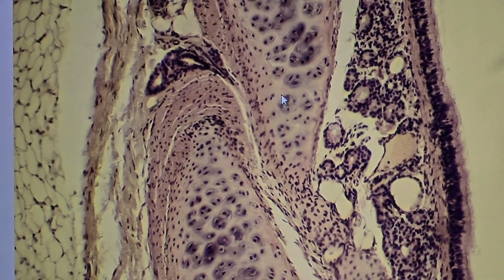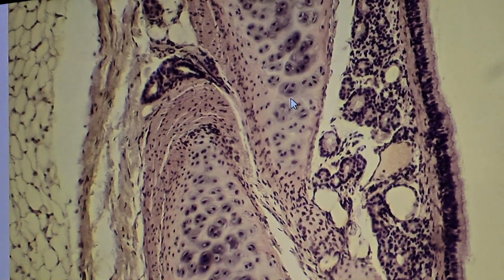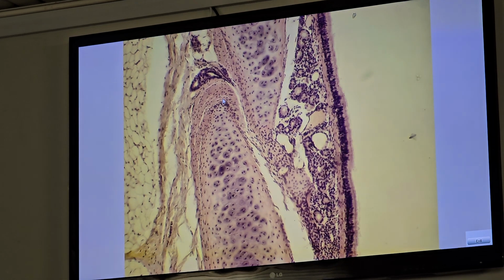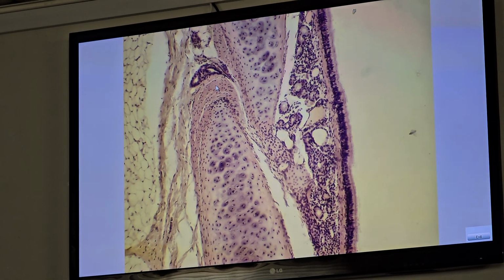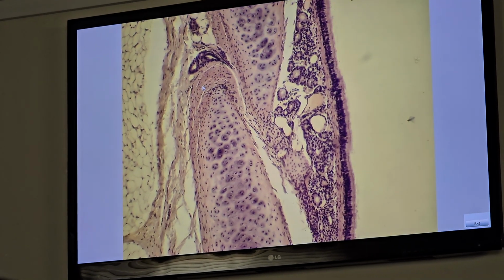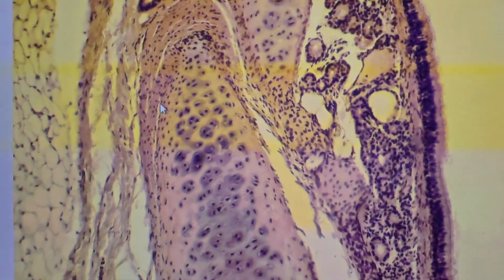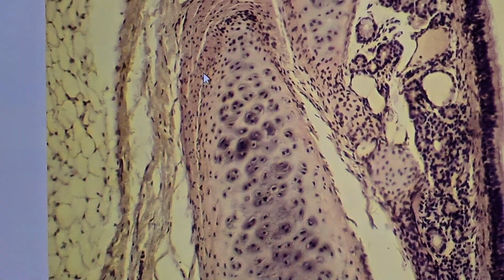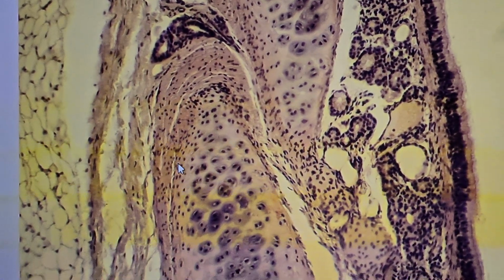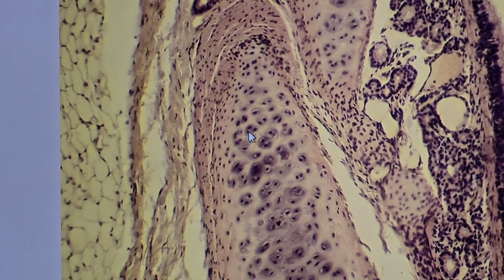The open ends of the hyaline cartilage ring on the posterior surface against the esophagus are bridged by smooth muscle fibers called trachealis muscle with a sheet of fibroelastic tissue attached to the perichondrium of the hyaline cartilage.